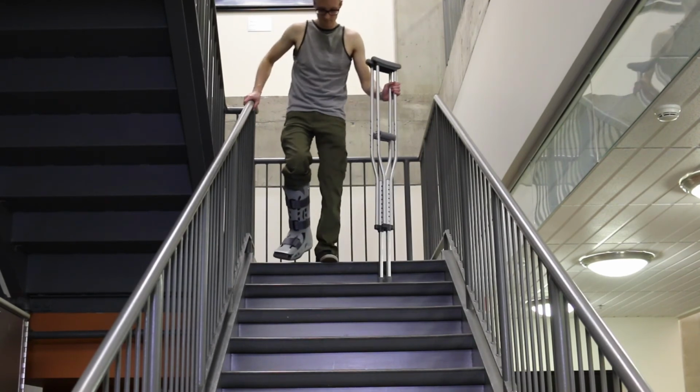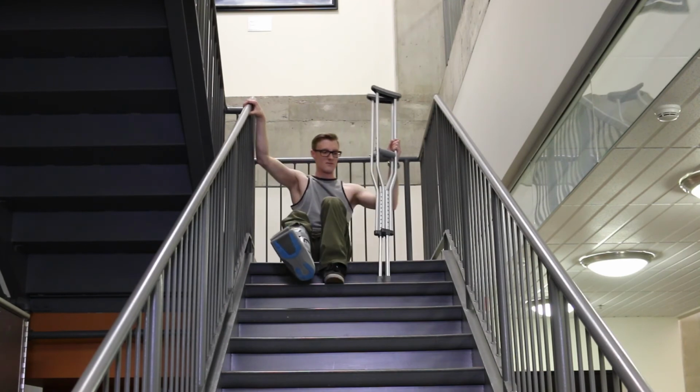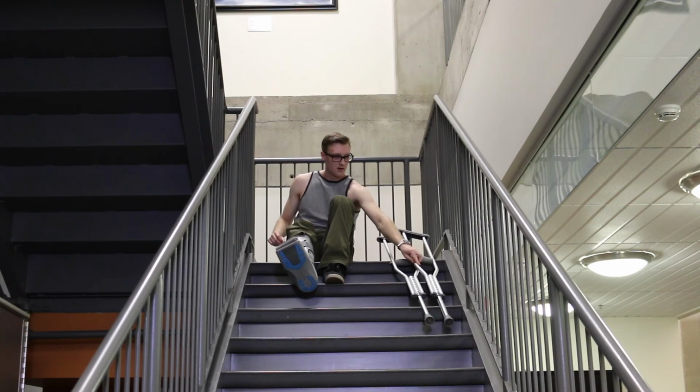Going down is a similar way of lowering the crutches down the stairs, having a seat at the top of the stair, and lowering yourself down. Repeat until you're at the bottom step where you can stand up and ambulate.